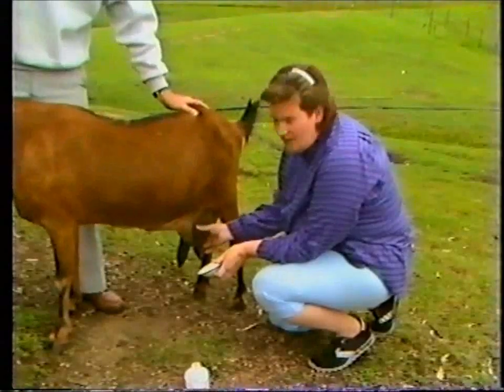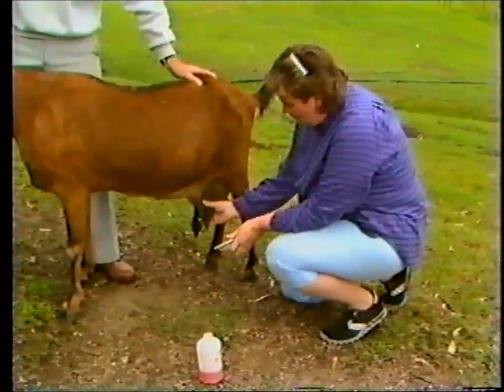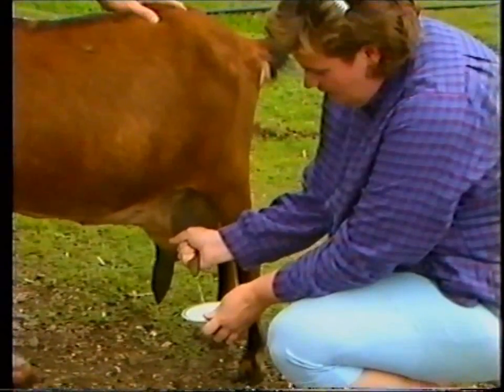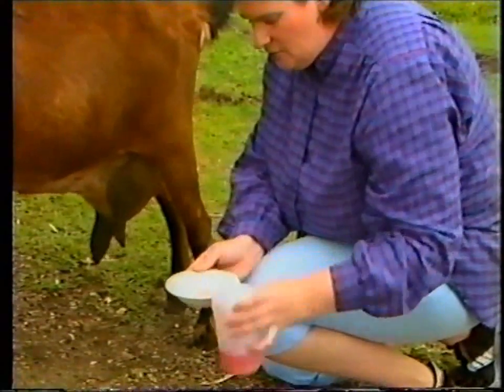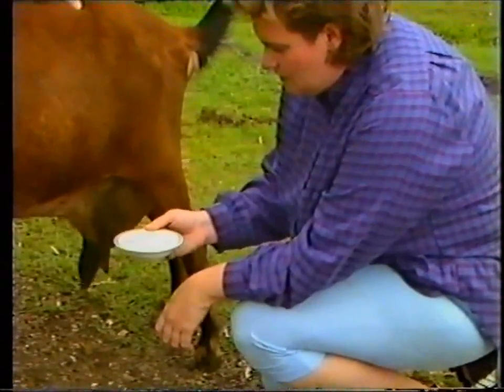This goat has had a previous attack of mastitis on this side — you'll notice it's smaller than the right-hand side. I'll check if mastitis is still present. I put in a volume of milk, then add the rapid mastitis reagent. This mixture is swirled slowly for 30 to 60 seconds.